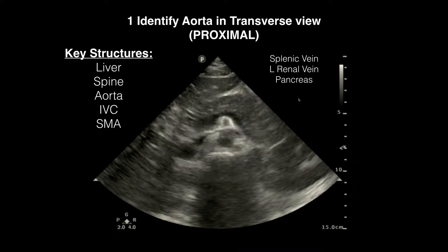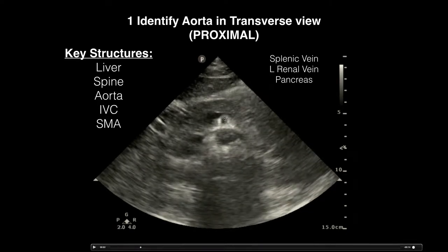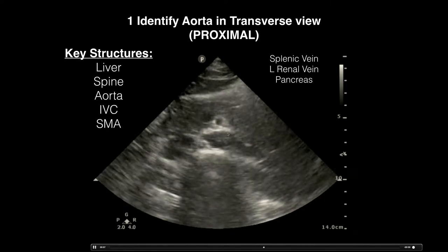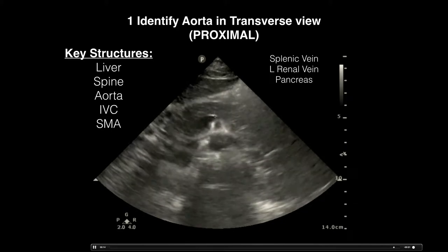Coming down a bit further into the proximal view, look for the liver and spine with its shadowing. Above the descending aorta you'll notice an anechoic round structure — that's your SMA, your superior mesenteric artery. Above that is the splenic vein. You'll also see the IVC with the left renal vein draining into it, and the pancreas enveloping the splenic vein.